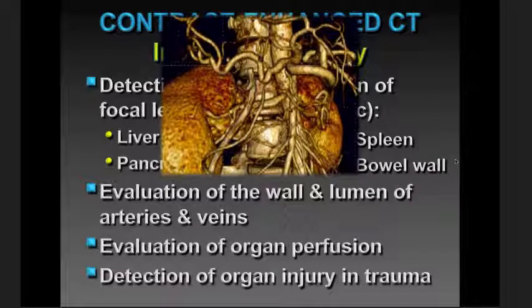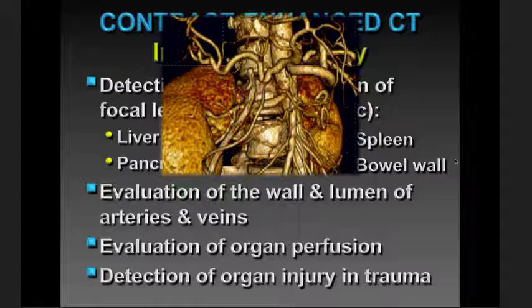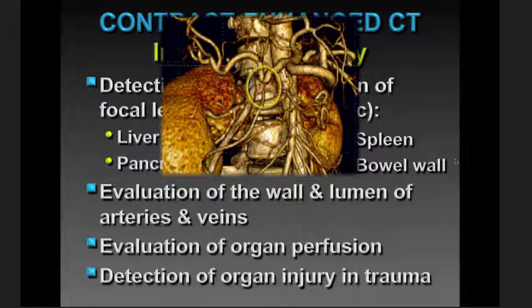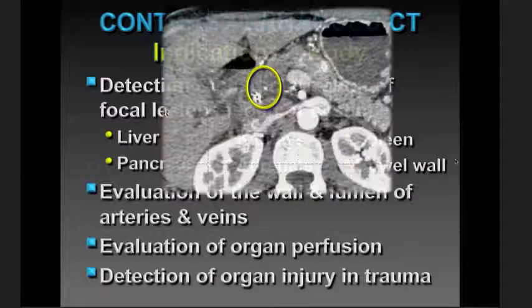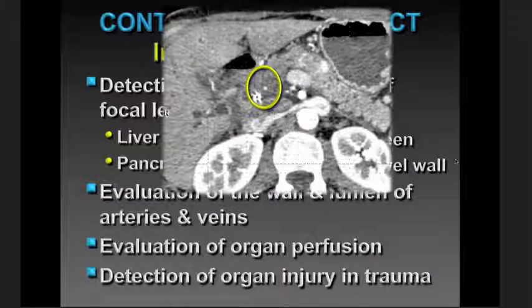Here's an example of a patient who had a CT angiogram for evaluation of the pancreas. Although these are not very reliable for finding tumors because often the tumors themselves don't have irregularity or encasement of the vessels, you can see that there is actual narrowing of the proximal gastroduodenal artery. It's actually helpful in this case because if you look exactly in that location on the axial images, you can see that the narrowing corresponds to a hypoenhancing mass in the head of the pancreas. You can also see that there's a biliary stent.